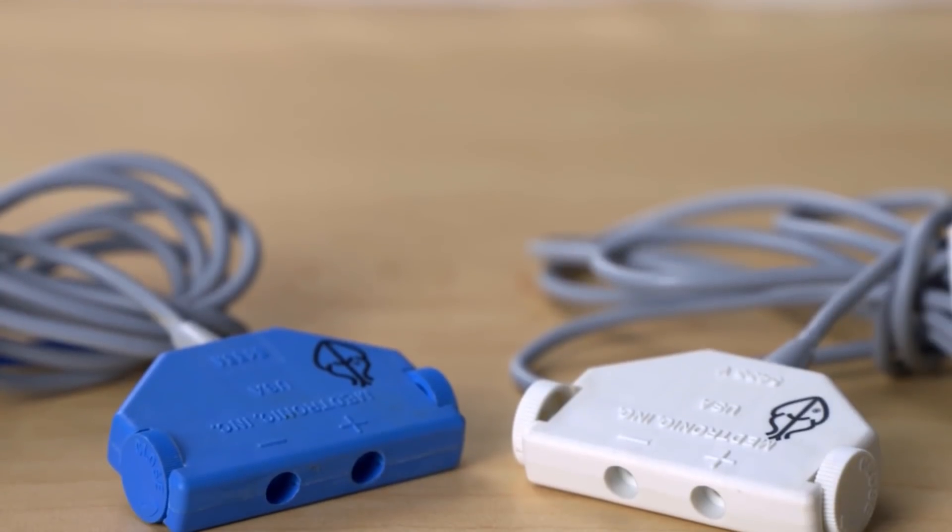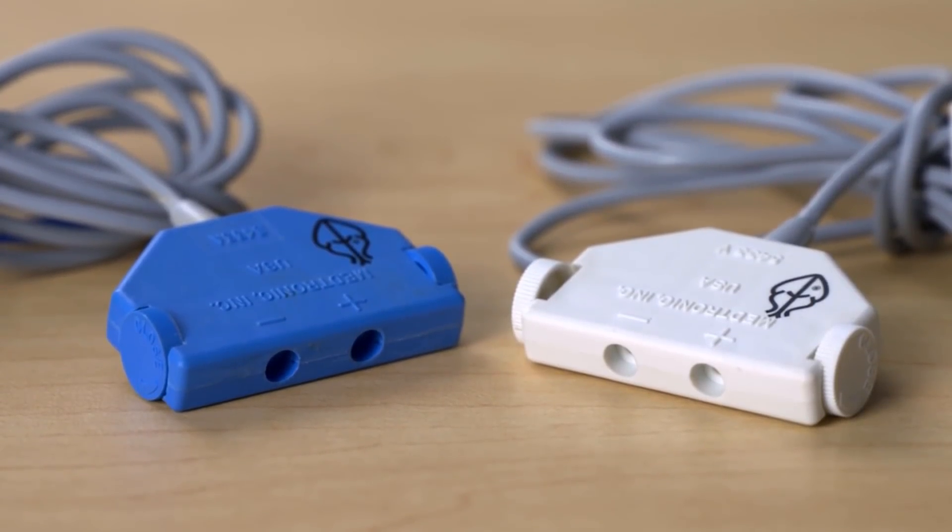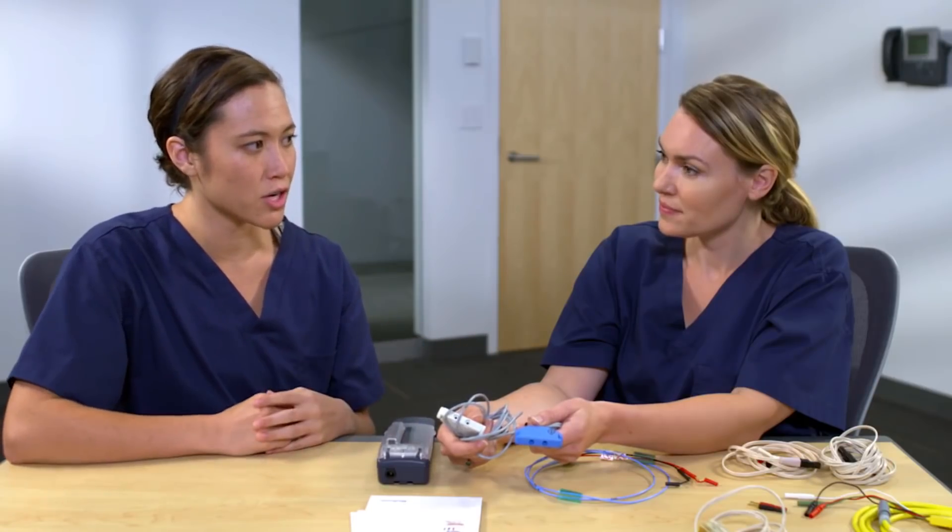Now I'll show you how to connect a pacing lead to a 5433 cable. Why are the connector blocks different colors? The reason for the different colors is to be able to determine quickly which chamber is being paced. The blue cables are for atrial pacing and the white cables are for ventricle pacing.